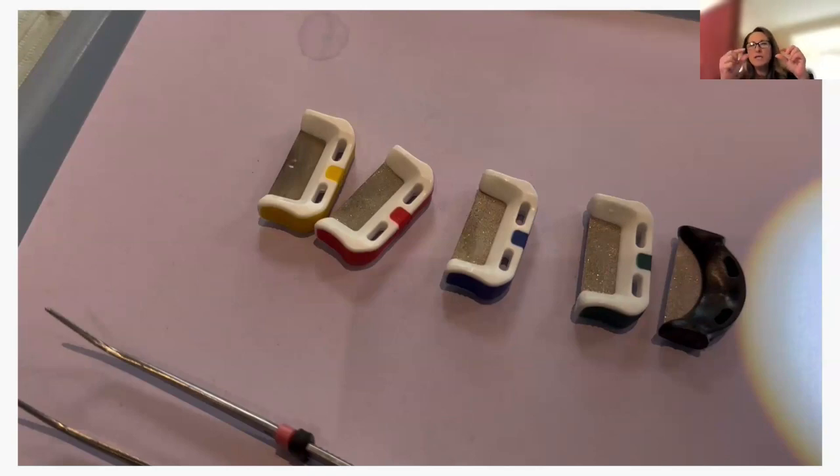And same thing to engage their aligners after you have placed the attachments on, chewies. And if you don't have chewies, you can always give the patient some cotton rolls, or I even cut off a saliva ejector in little pieces so they can take that home to engage their aligners also.